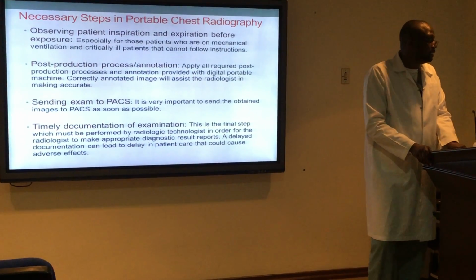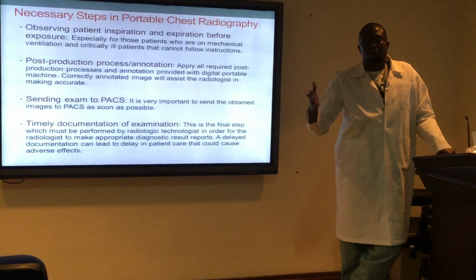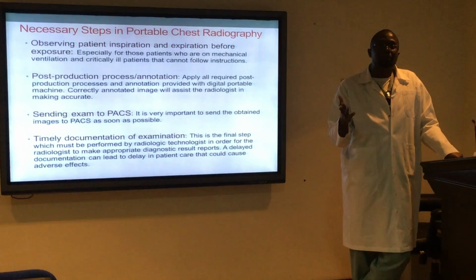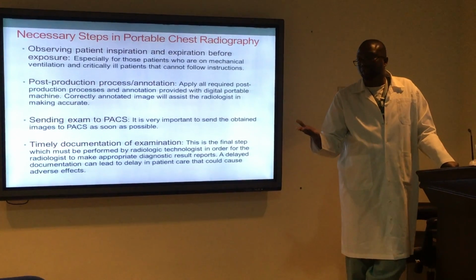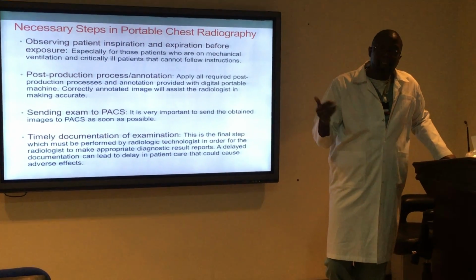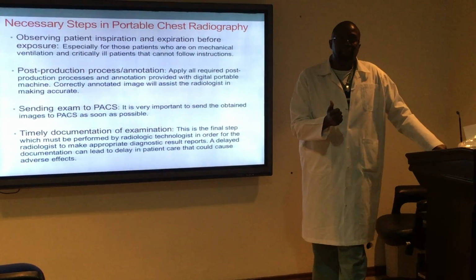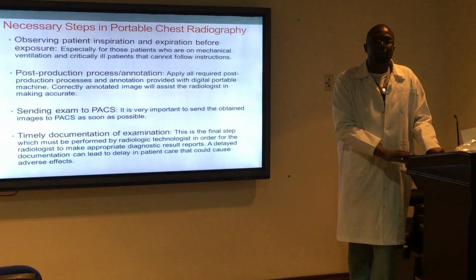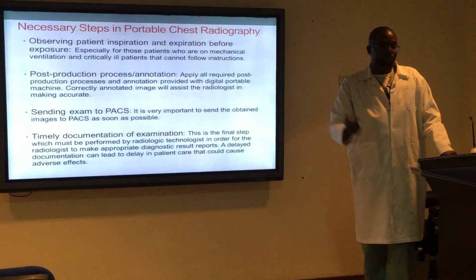This is very important because when you put correct annotation, this will help the doctor in giving a good diagnostic report as well. If you do a patient in a supine position, you have to indicate on your image. If you do it in AP sitting, you should be able to indicate it. If you do a decubitus, you should be able to indicate it on your exam. If the exam is done in PA or AP.